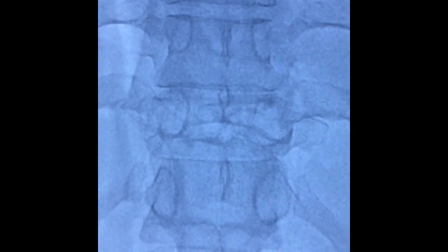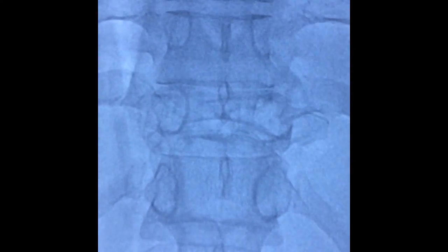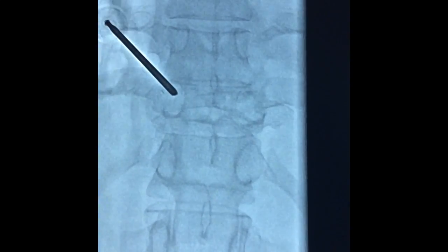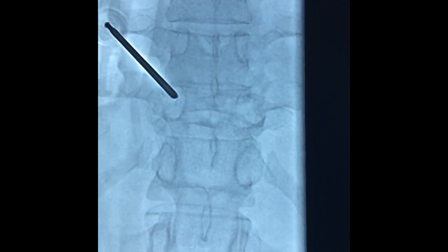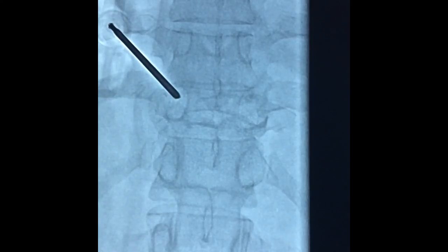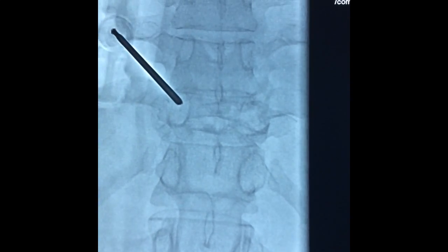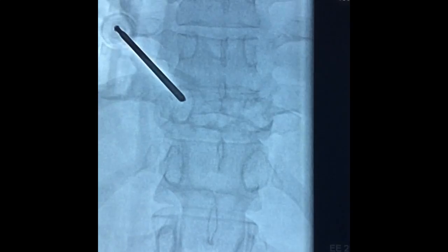Examination of the spine under fluoroscopy — this is the AP view showing a compression fracture of the D11 vertebra. It's a beveled needle from Cook, which we placed under fluoroscopy guidance into the pedicle on the left side. We try to advance the needle into the center and as far anteriorly as possible.